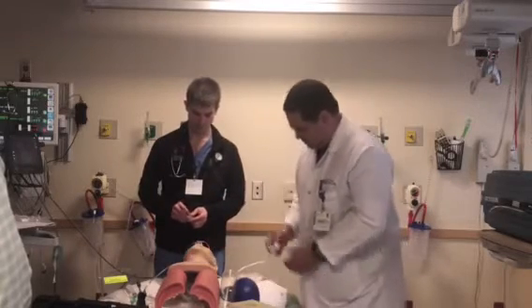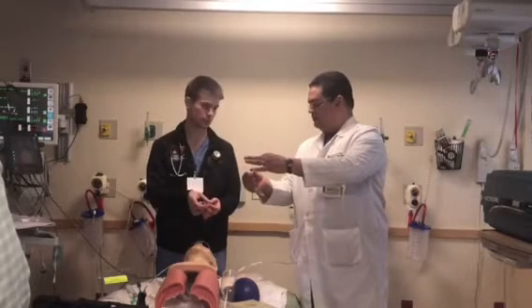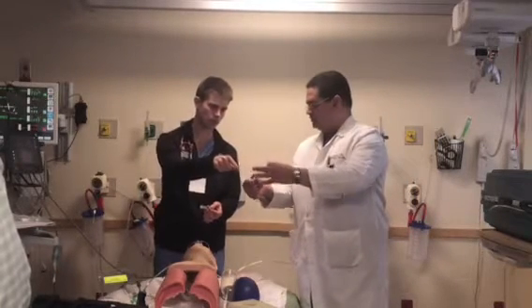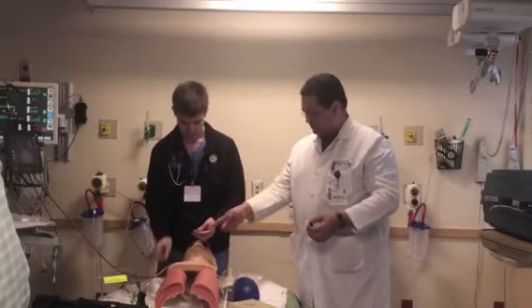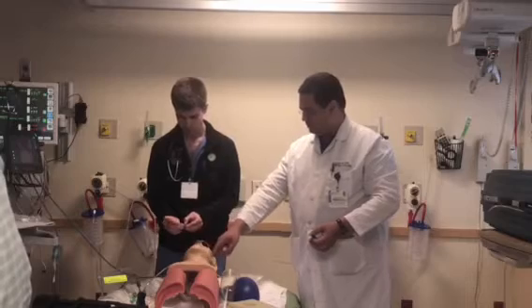What's the next step? So we have access. We pop off the syringe, leave the needle in place. So pop off the syringe, show me the needle, take the cover off, and put it above the patient so everybody can see it.